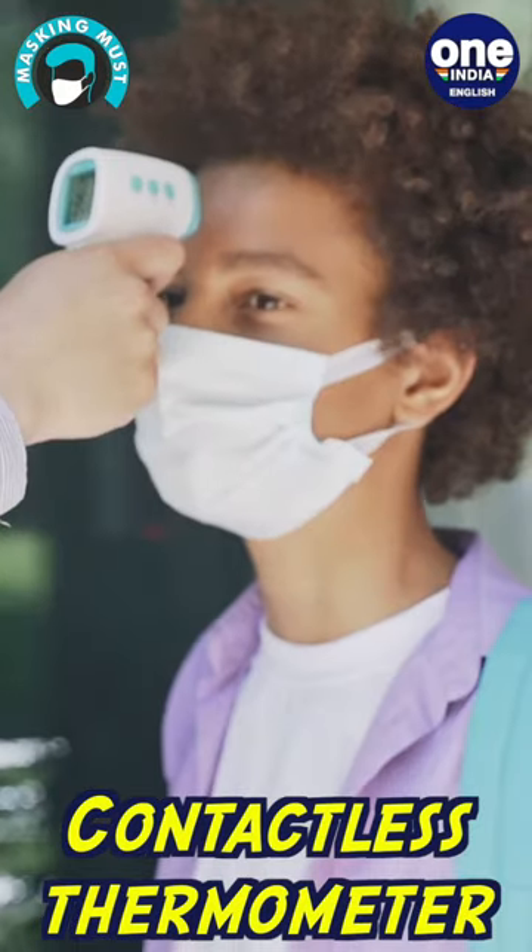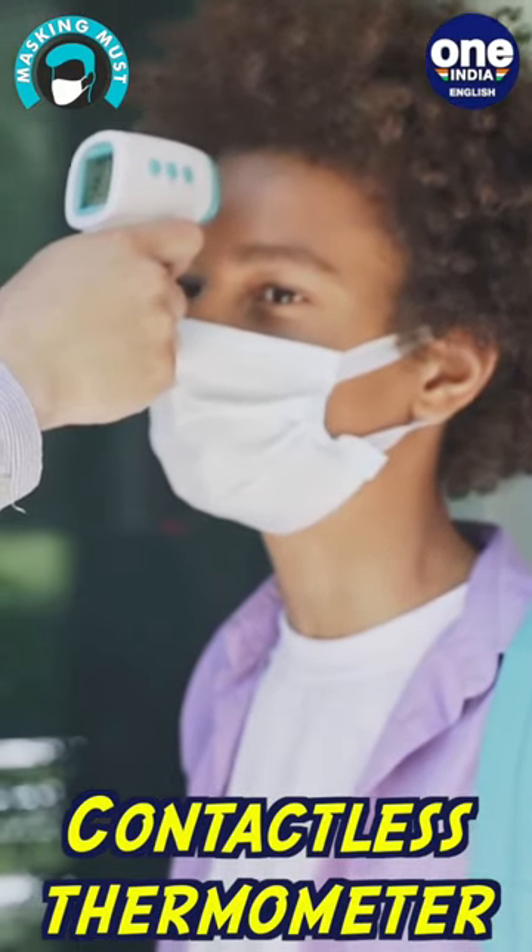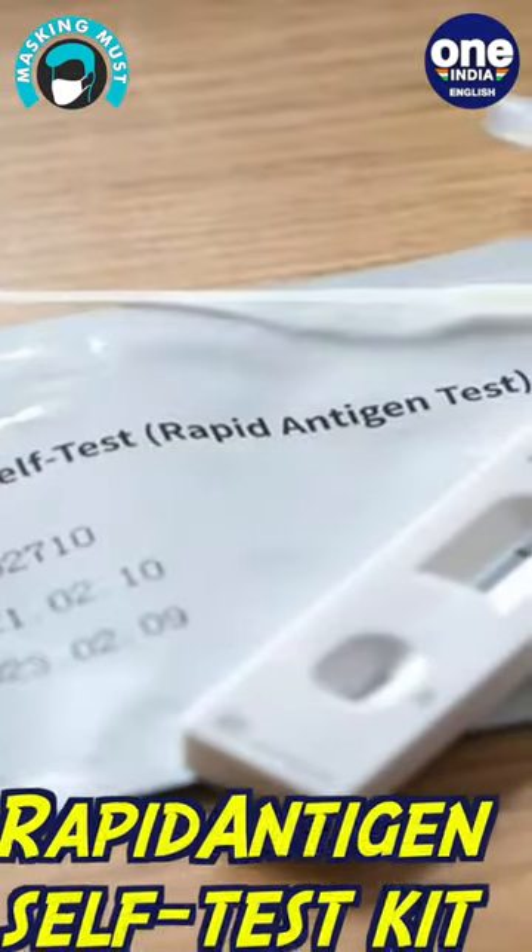Non-contact temperature assessment devices can be used for both the residents of a particular house and the guests, as they can be used to measure a person's temperature without coming in contact with the person.